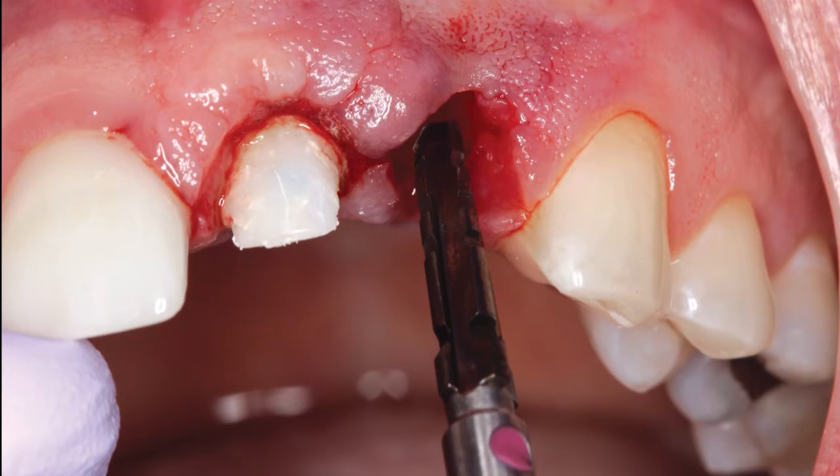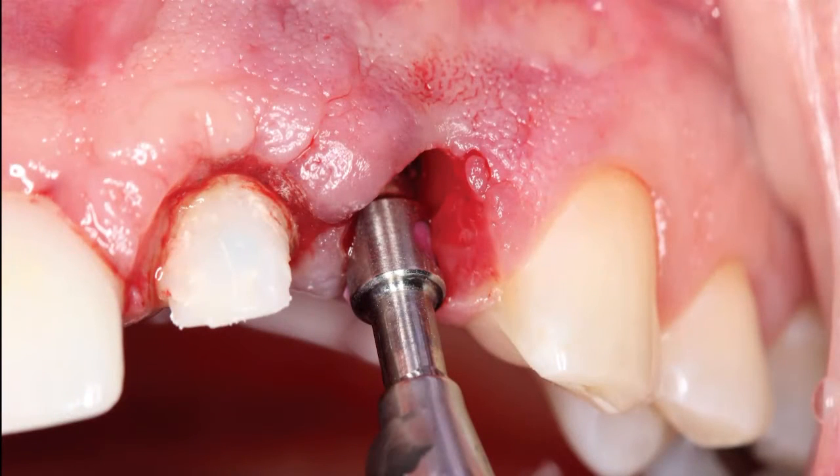A pilot drill was utilized to create the initial osteotomy approximately 3 mm apical to the adjacent cementoenamel junction. A 3.5 mm diameter Replaced Select drill from Nobel BioCare was used to complete the preparation of the implant site. The Hahn tapered implant system is compatible with widely used implant instrumentation, making it easy to transition to a new implant system.